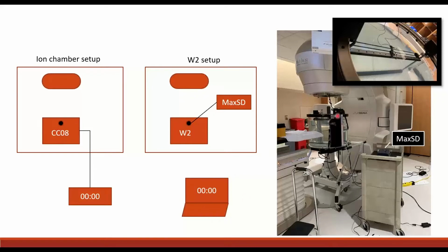What we did to get it to work with our scanning tank was simply call it a diode so that no voltage needed to be applied. And you have the option of using a reference detector. If you want to use a diode for the reference detector, because it also doesn't require an applied voltage, then you can, but we chose not to because we just don't have any diodes that we regularly use on hand.